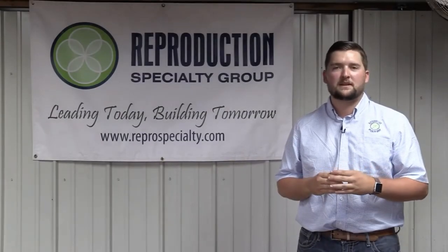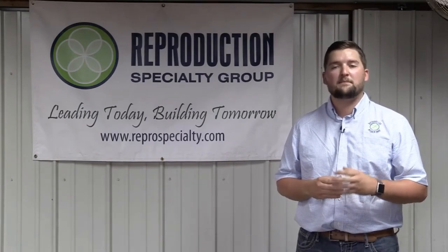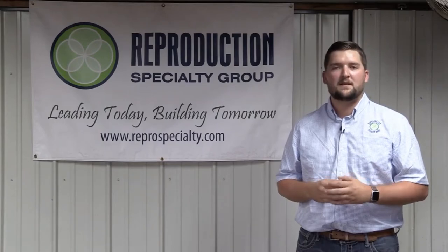Today we're going to learn about how to properly split a can of semen. To do that we're going to find our head embryologist and manager of our semen collection and freezing, Mr. Billy Wade.